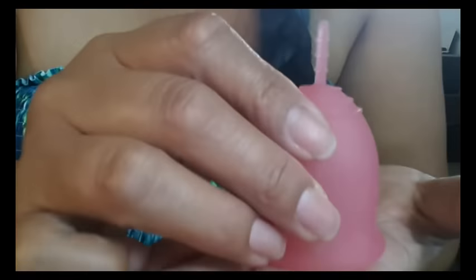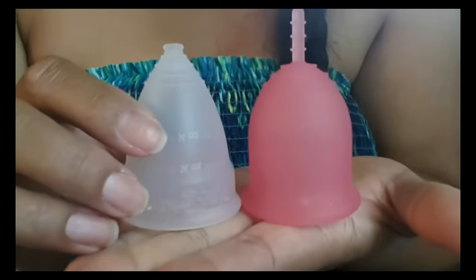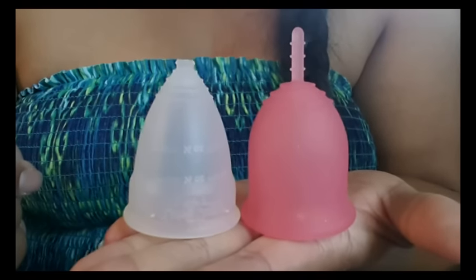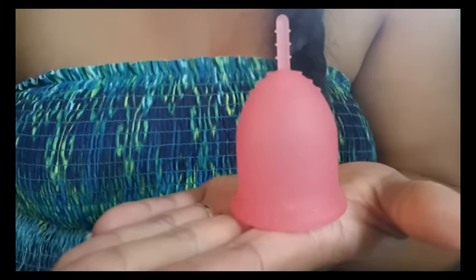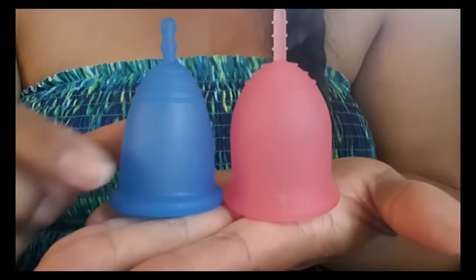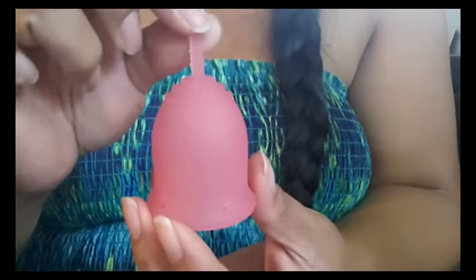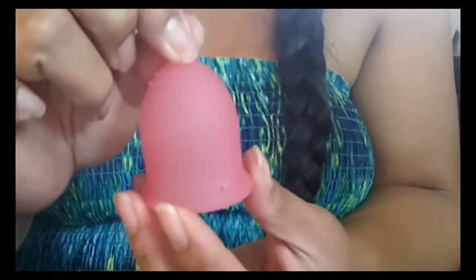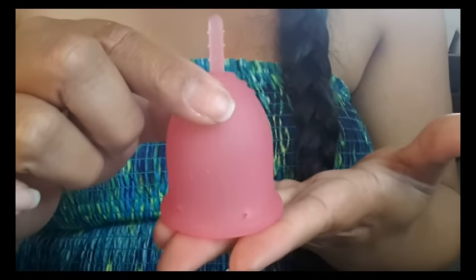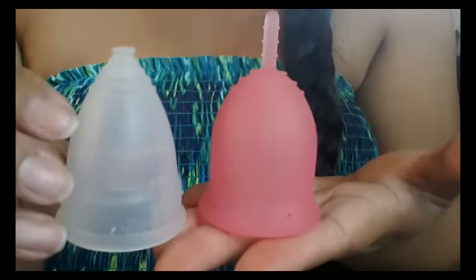I'll go ahead and compare it to the Diva and the Maluna Large since those are cups that people usually like to measure off of. Here's the Diva cup size 2 and the Maluna Large. This is a bell-shaped cup, and some people say that bell-shaped cups are good for people who have a low cervix — it's more comfortable and a little shorter than V-shaped cups like the Diva cup.